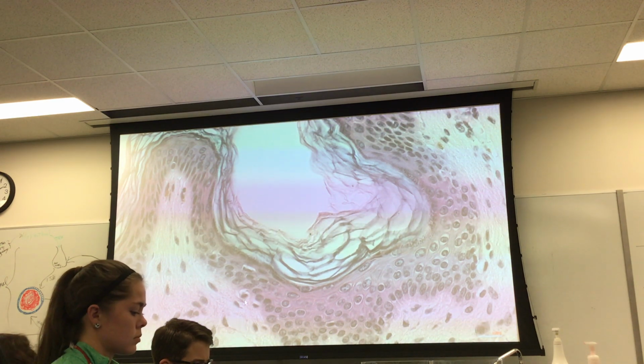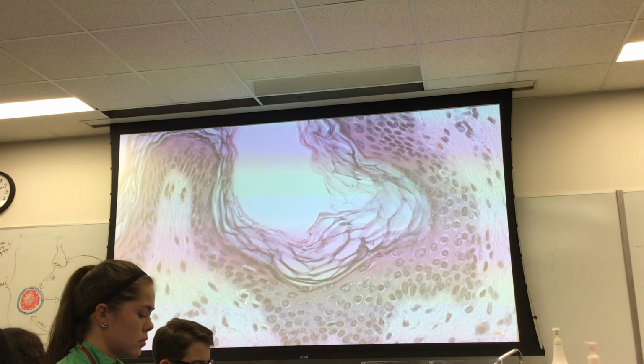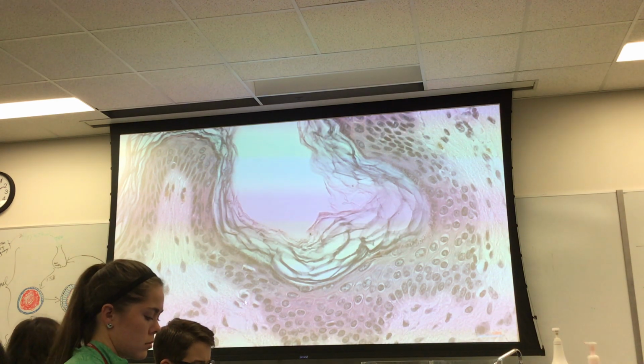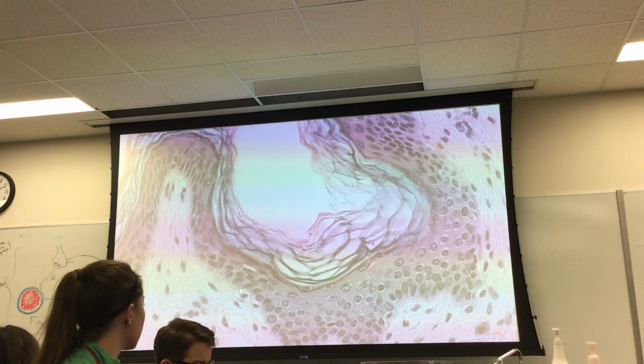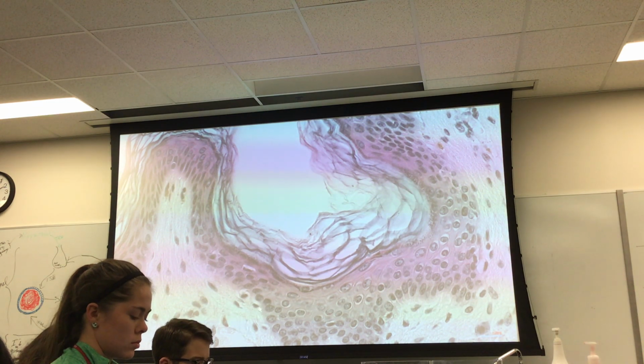I'll tell you this, it's a part of the basale. That is a melanocyte. Key feature. It's going to be in the stratum basale or close to it. These will tend to show up to you in basale. Here's another one up here. It's always surrounded by kind of like a halo, very light staining, just cytoplasm doesn't stain. The rest of the cells are more or less called keratinocytes, but this one's called a melanocyte.